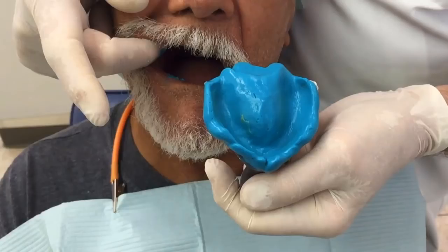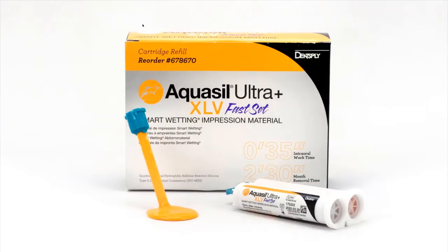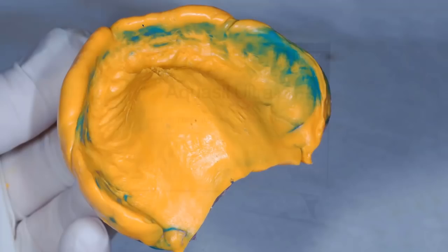Ninety-nine percent of the time you're done — this is your final impression, and we're probably 10 to 15 minutes into that 30-minute segment. If you see any defects or want to increase fidelity, you can use Aquasil Ultra XLV, extra light viscosity, and apply that in — it's very water-like. Put it in the mouth, border mold, and remove in two and a half minutes. Then repeat the process on the mandible. Newcomers take about 40 minutes, but most people get it under 30 once everyone is organized and auxiliaries are trained. It's a team effort.